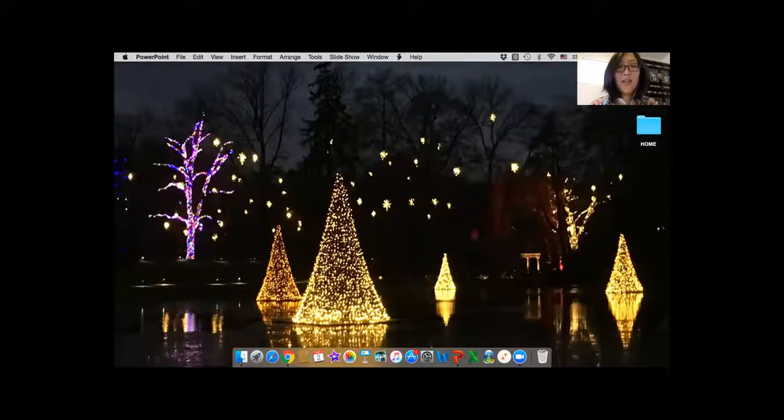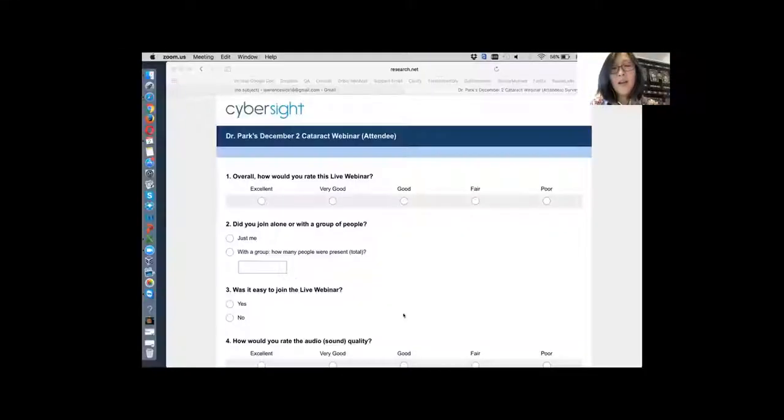Intraoperatively, how do you manage a hazy cornea? If you have a hazy cornea intraoperatively, you have to determine what the reason for that hazy cornea is. Obviously, if you have corneal scarring, there's nothing you can do about that. You're going to have to just see around it, or make other arrangements, or replace that cornea before surgery if it's truly a scar. If it's haziness because of edema, then you're going to have to make adjustments accordingly. A, you have to protect your endothelium with a dispersive, and B, you might have to scrape the epithelium if that's really causing a problem.